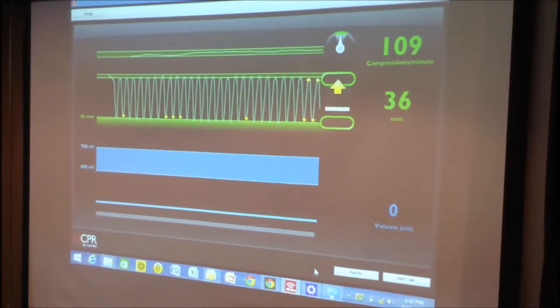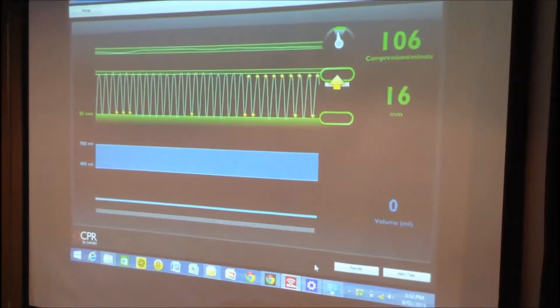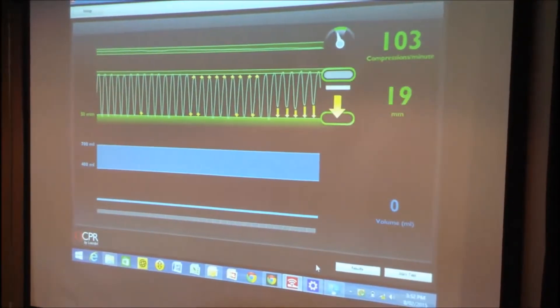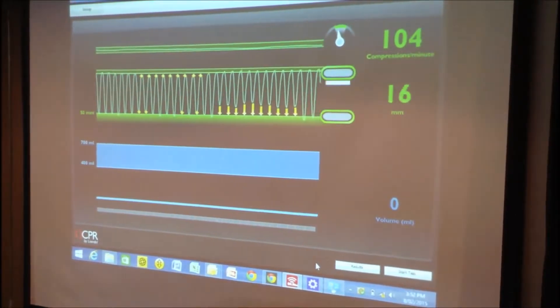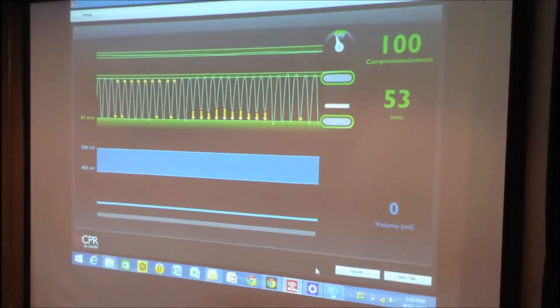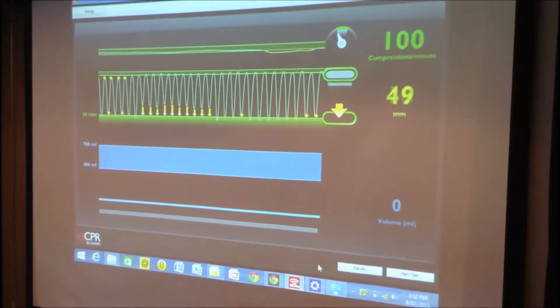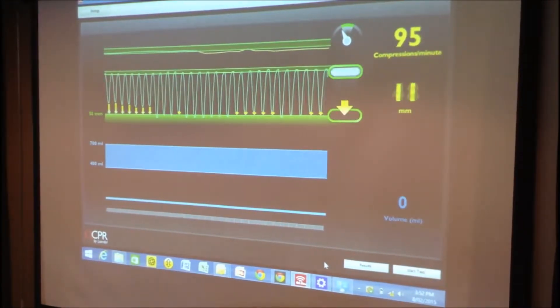So if I don't release effectively, what we should get is a yellow arrow telling me to release more effectively. Now what I'll do is achieve an effective release but I won't go deep enough. And now if I achieve adequate depth and release but I slow down too much, the top right corner is going to turn yellow indicating to me that I need to increase my rate. And this is how the software works in effect.